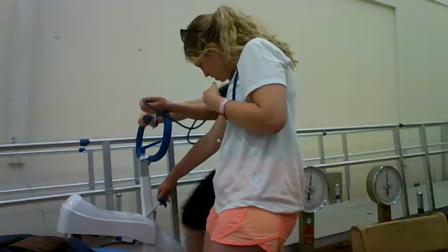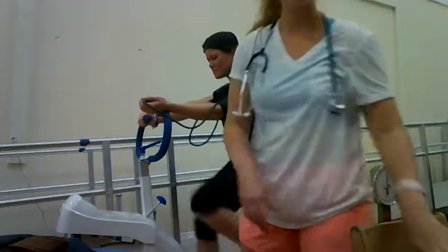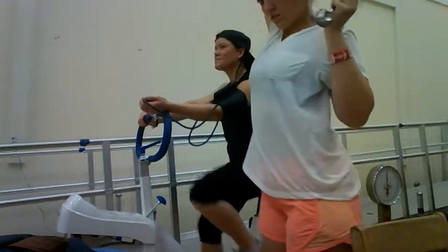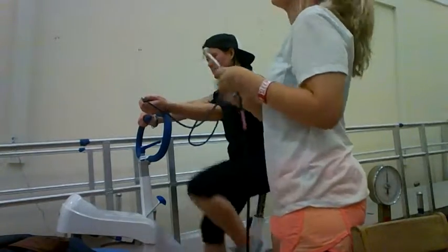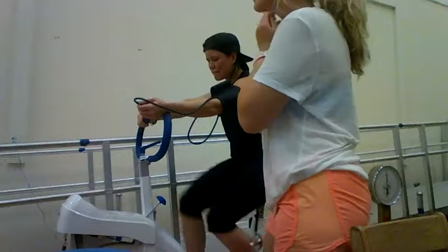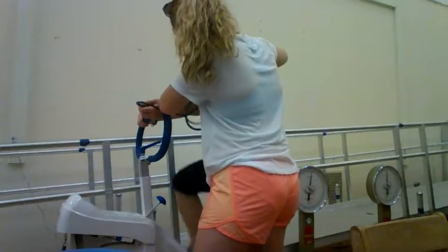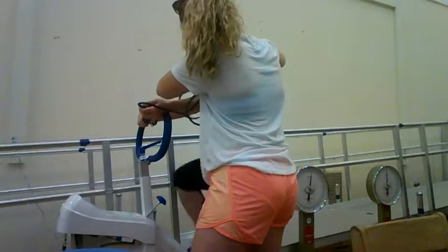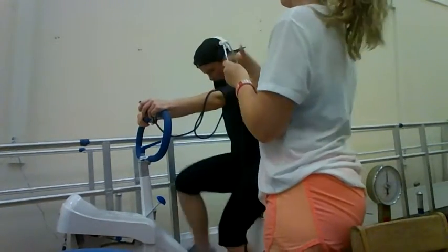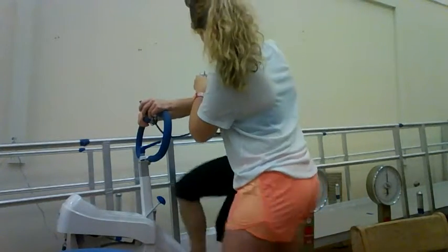We are now increasing the workload to 1.5 kiloponds as the patient has reached steady state for stage 2. The 1.5 kilopond workload represents stage 3. We have now increased the kilopond workload to 2 kiloponds. This represents stage 4 of the exercise test. The subject has again reached steady state, and we are now increasing the workload to 2.5 kiloponds.